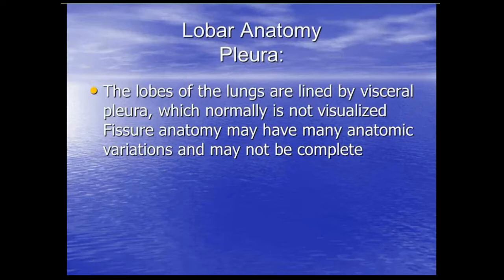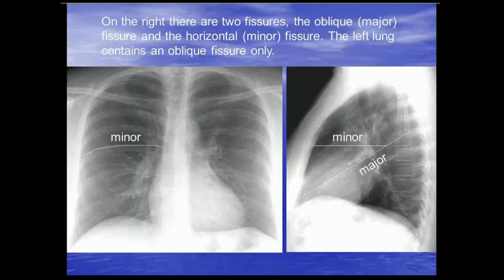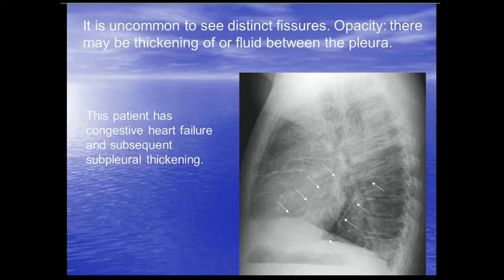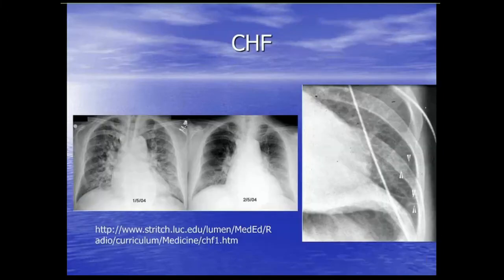The lobes are lined by visceral and parietal pleura, normally not visualized. Fissure anatomy may have anatomic variations and may not be complete. The most common variant is an azygos fissure — an incidental finding. On the right lung there's a minor or horizontal fissure and a major or oblique fissure; the left generally just has a major or oblique fissure. These are the oblique fissures, slightly thickened here because of some edema — the patient had a little CHF. This is another case of CHF or pulmonary edema where you can see the pulmonary vessels are prominent and Kerley B lines along with pulmonary edema on the lateral.